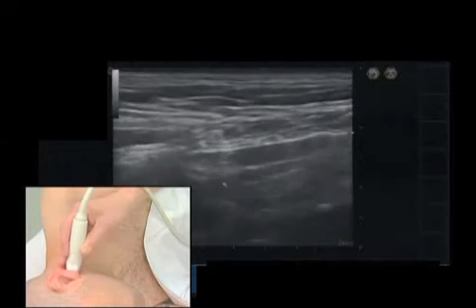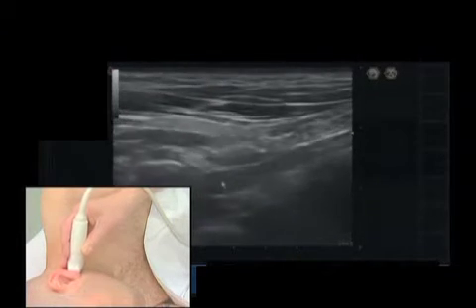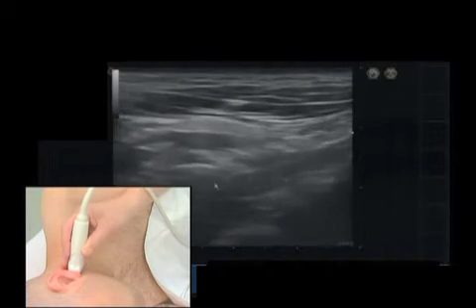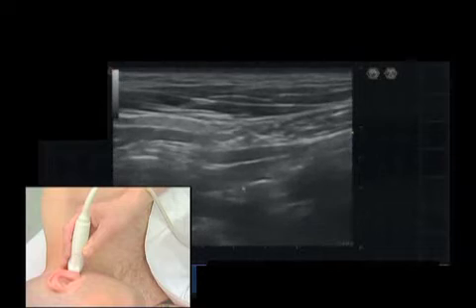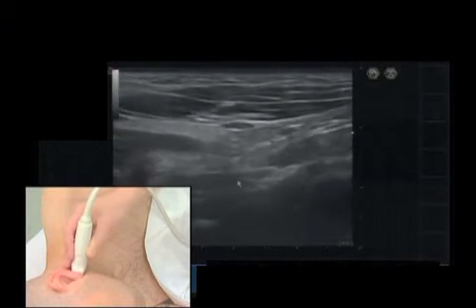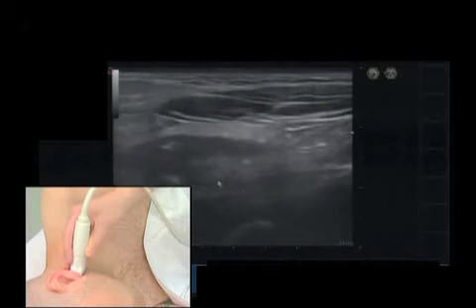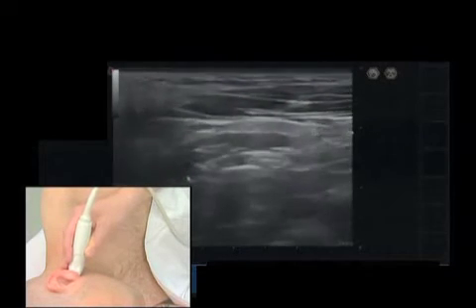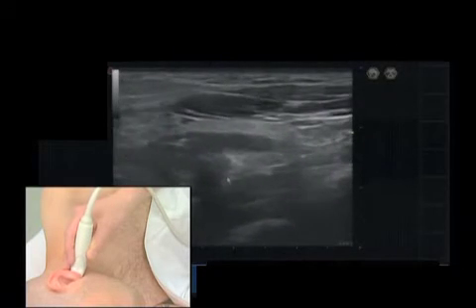If you move your transducer still more downwards, the transverse process of axis will come into sight. Importantly, if you look at that landmark, you have to recognize that the transverse process of axis is smaller.